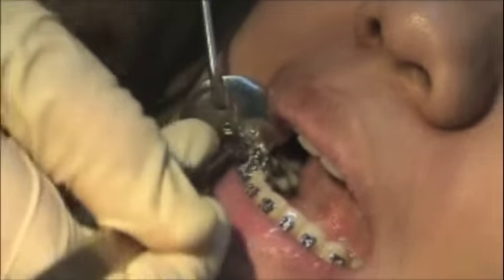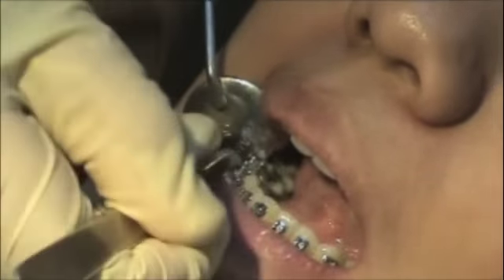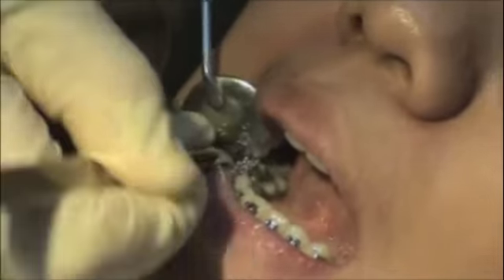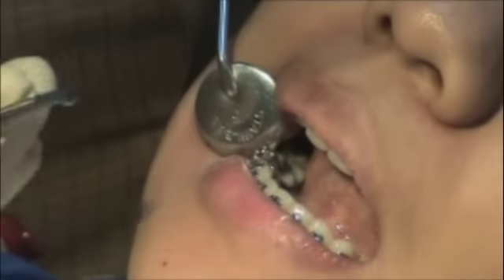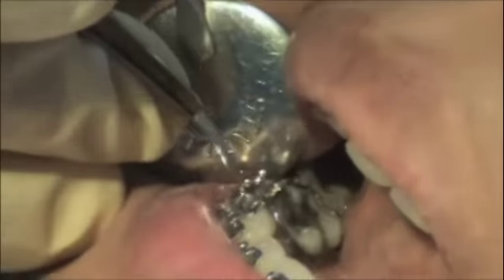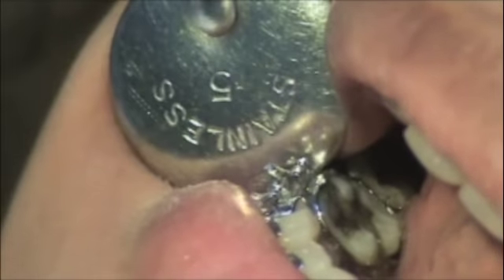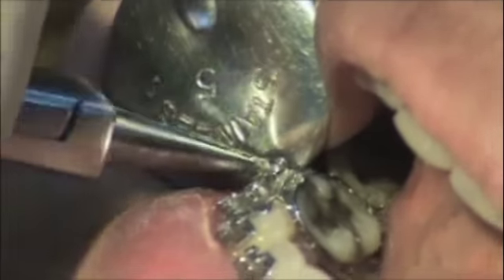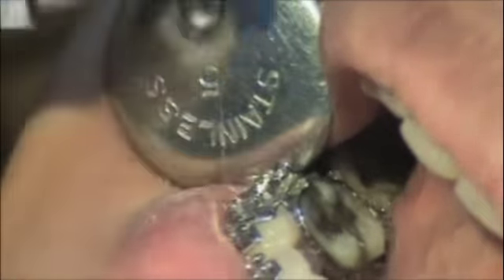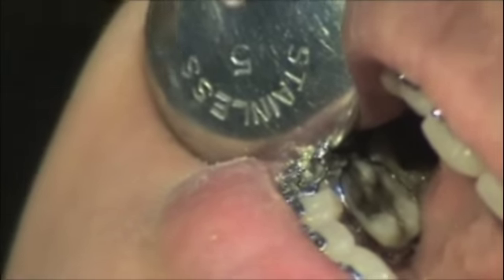And we're going to pry off. So here it comes. Now I take it off about halfway, and I will grab the end with the white wire and twist it. Then I don't have to worry about it ending up in the back of the mouth somewhere and having to fish it out.